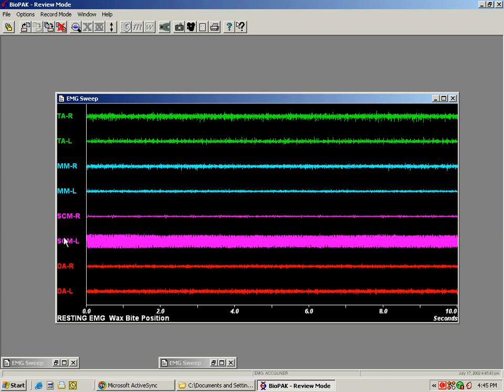Now these labels can be changed if you go into recording presets, and that way if you decide to record different muscles and place the electrodes in different places, these labels will be changed as well.